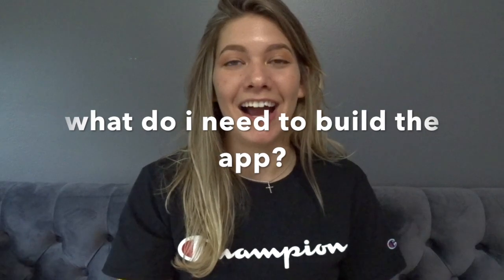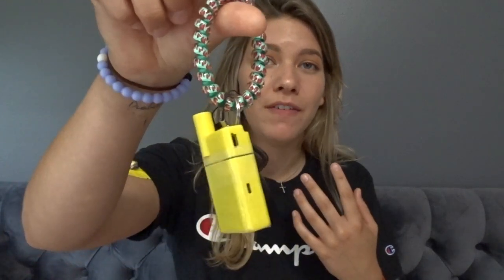But next question is, what do I need to build the app? You need a Mac, an iPhone, an Apple app developer program, which is $100. You need the Riley Link, which is $150. And you need a pod and a CGM, and that's it. The only CGMs that work with it are Dexcom and the Medtronic CGM, and the only pumps that work with it are the Omnipod and the Medtronic. That's it for right now.